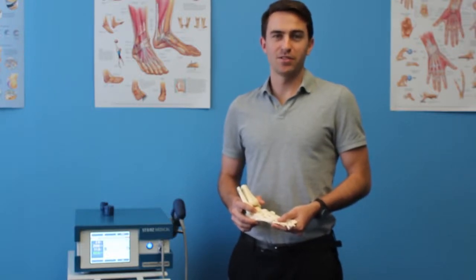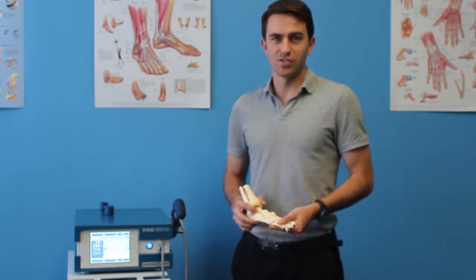Hi, my name is Mark McGibbon and I'm a registered physiotherapist here at Ace Physiotherapy. Today, we are going to demonstrate to you the treatment of plantar fasciitis using the Storz MP200 shockwave therapy machine.